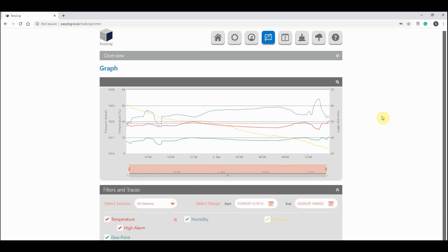Under the graph we have the filters and traces section. Rather than looking at all the results as a whole, you can pick which session you want to look at. New sessions are created each time you start the logger. Each of these sessions will then become available to analyze in this drop-down menu.